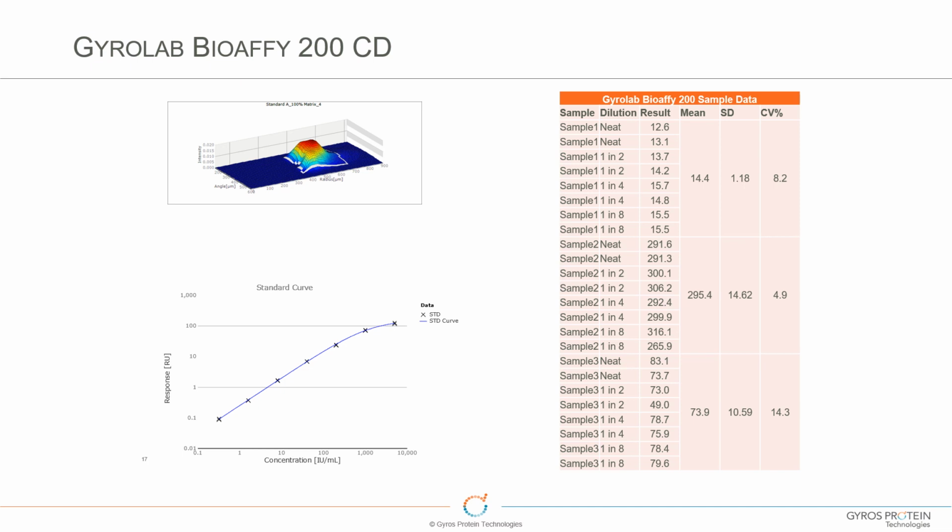What we did find is that with the lower volume CD, the 200 CD, we did get parallelism. So there's obviously a matrix effect happening at the higher volumes. We actually did get parallel dilution with the 200 CD. But as Rob was mentioning, people that want to switch CDs would prefer to keep the same column type. So it would be better to have a 200 HC CD for when you directly want to move the assay between different CDs.